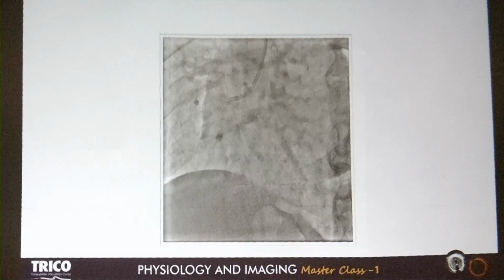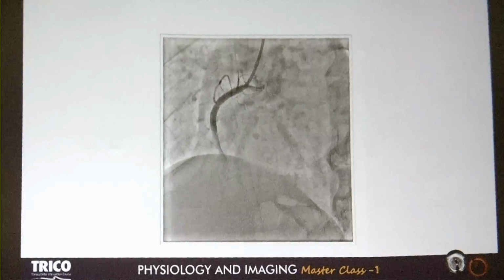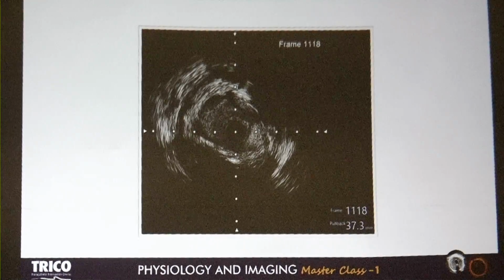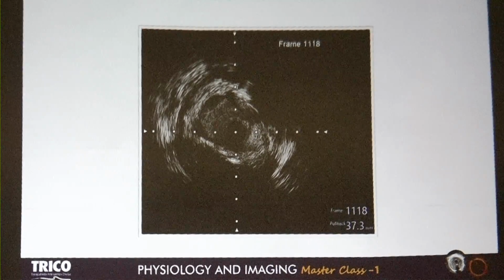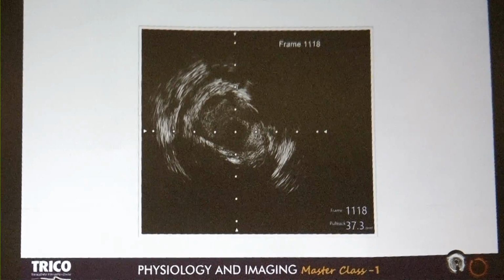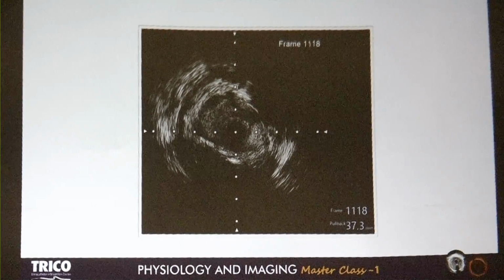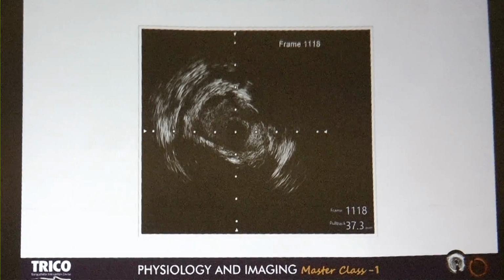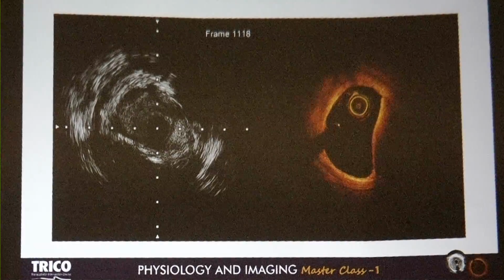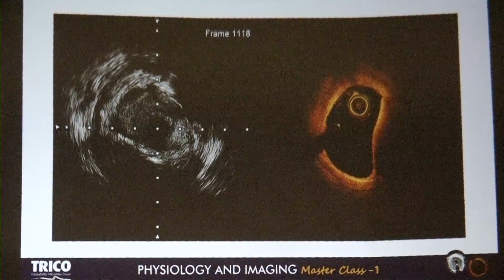Somewhere the plaque must have ruptured. This is the IVUS picture of the same area. What is this? Large hematoma.